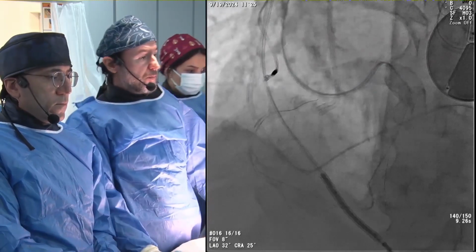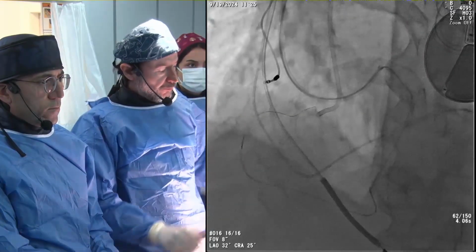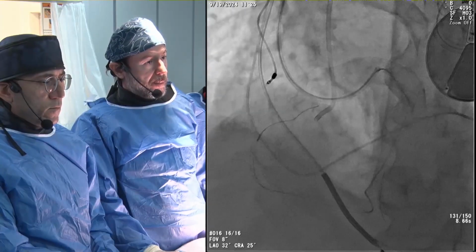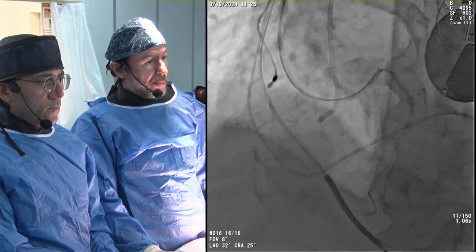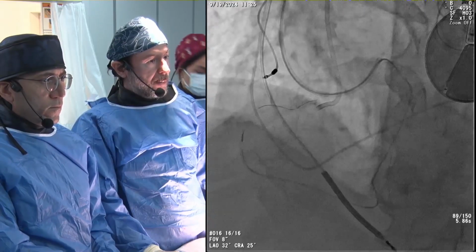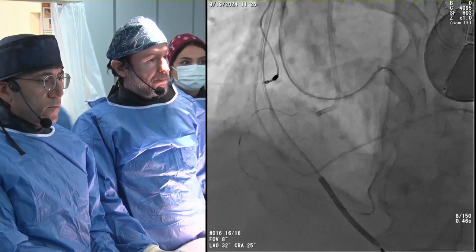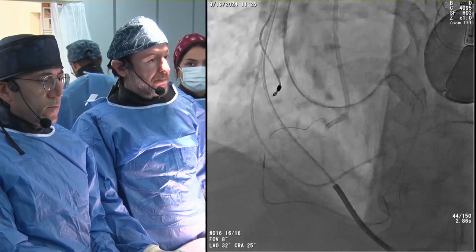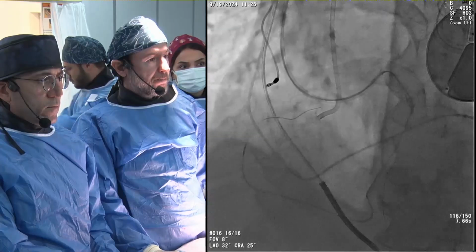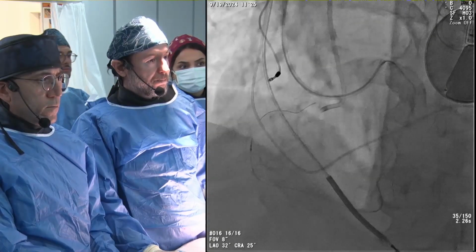Okay. Yeah. Thank you very much. It's so far a nice demonstration for the RCA ostium, right? So we can see the calcium, and we are very happy to see that this challenging case is pretty nicely done so far by your skill as well as good judgment. And today we are very happy to have a lot of specialists here, because sometimes the ostial RCA can only be crossed with a retrograde wire. But if not possible, probably some kind of antegrade approach may be necessary at the end.